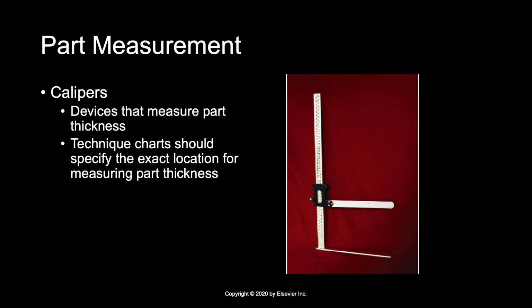Measurement of the part thickness must be standardized throughout the radiology department, and we must always measure correctly. You're going to measure through the central ray. So wherever the central ray is located on the body, that's where you're going to put the calipers and measure through that area.